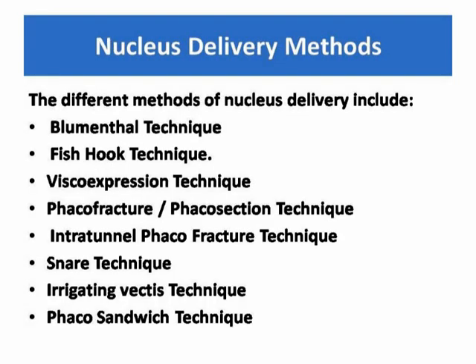The different methods of nucleus delivery include the Blumenthal technique, fishhook technique, visco expression technique, phaco fracture, phacosection technique, intratunnel phaco fracture technique, snare technique, irrigating vectis technique and phaco sandwich technique.